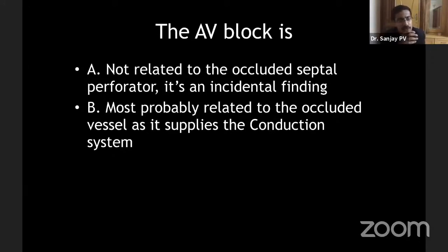Yeah. So there are some PVCs, particular PVCs of the outflow tract morphology. Where you have a left bundle branch block morphology with an inferior axis, 2, 3, AVF positive, AVR and AVL negative. So that's a classic outflow tract morphology, either an RVOT or an LVOT. And the patient has a significant, you then do a Holter. So the patient comes to you with palpitation. You see the ECG, you have 4 or 5 PVCs on the ECG. You do a Holter and you record the Holter burden. Say you get a burden of say just 5% or maybe just 5,000 beats, then you don't do anything. Just reassure the patient. Just tell them it's an incidental finding. So they are benign PVCs.